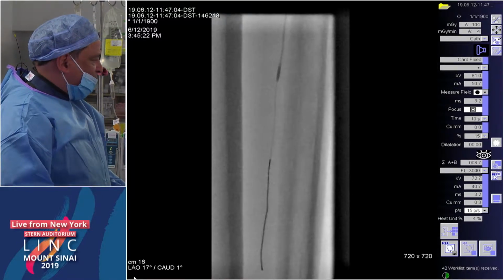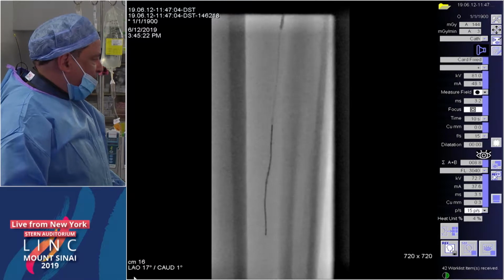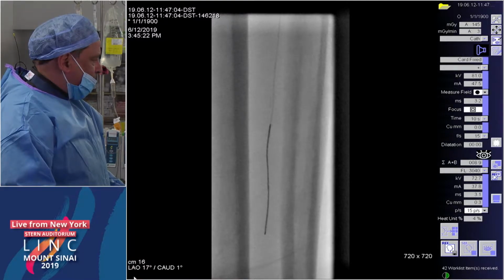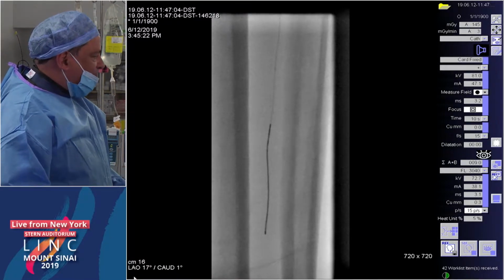Our coronary team is quite advanced in their abilities. So we cross-pollinate like we all do in our labs, and hopefully that cross-pollination will help this lady. Yeah, Teleport. I'm still with the hydrophilic wire, as you can imagine. It's really just a hydrophilic wire there.